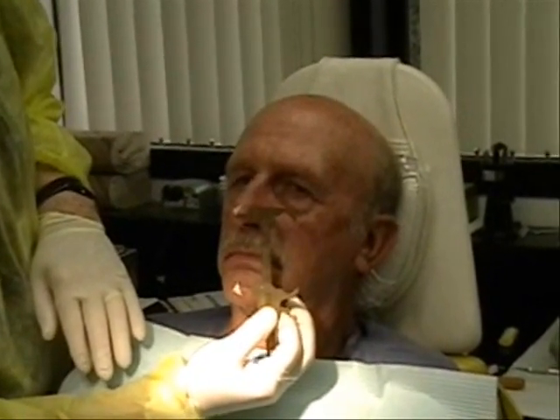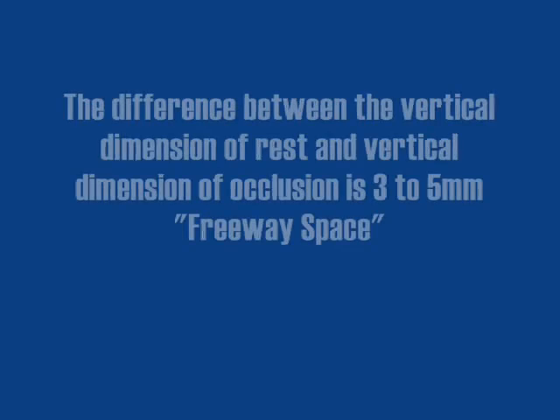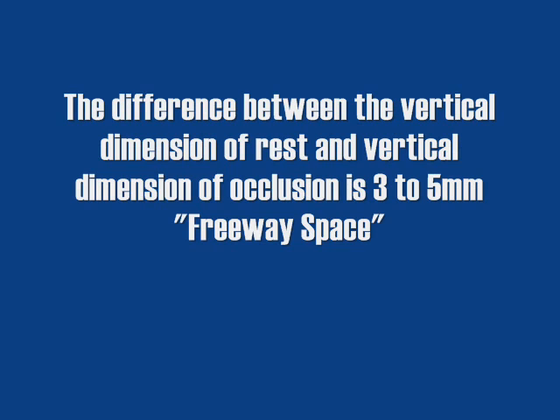It's about time to test the speech. Let's try it and see. Just say 55 and 666. 55, 666. That's pretty close — it's not touching. Say 'this,' 'that,' 'judge,' 'church.' Pretty darn good. You like it? Mississippi. Close to speaking space — he's about a millimeter apart.